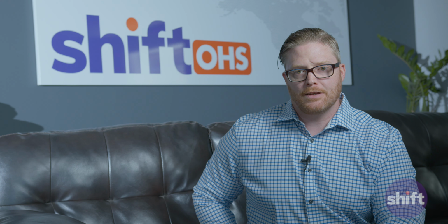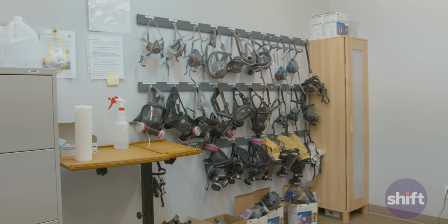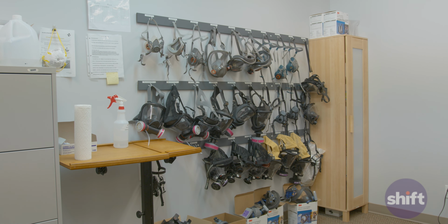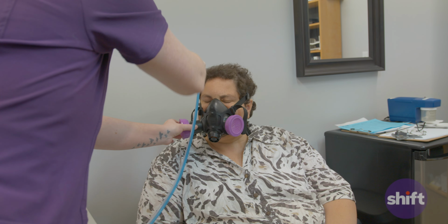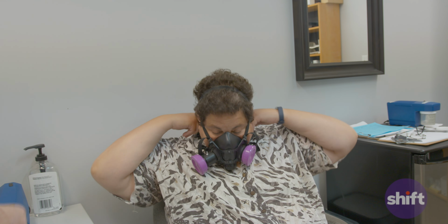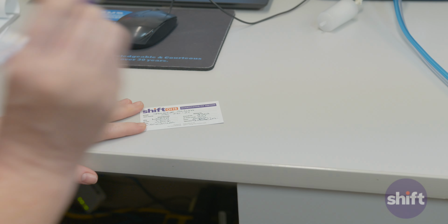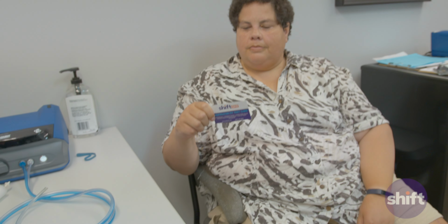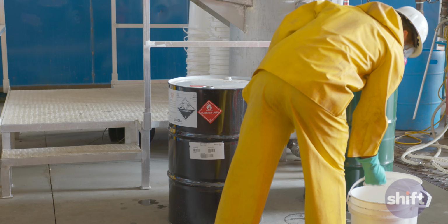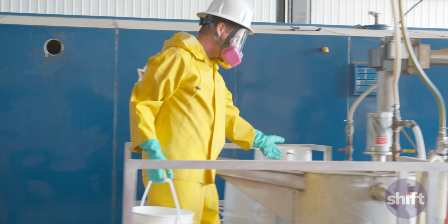The instrument then identifies the overall fit factor of the respirator. Each respirator has a fit factor that is required to be considered a pass. If the required overall fit factor cannot be achieved, a different size, model, or brand of respirator may be required. If a pass is achieved, the worker will be provided with a respirator fit test card that contains information about the respirator brand, model, and size. The results of both the fitness to wear respirator evaluation and the actual fit test will then be reported to the employer.